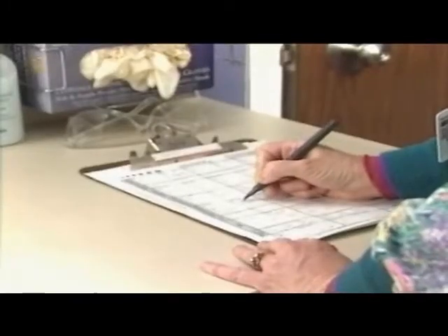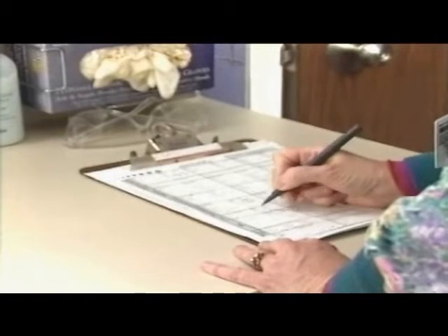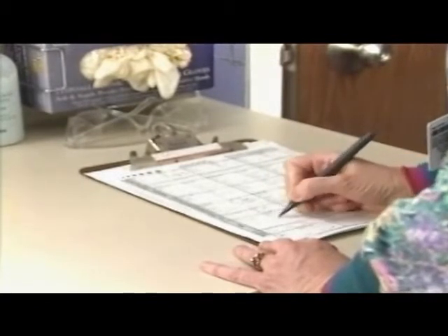Record appropriate information including color, amount, consistency, and the patient's response to the procedure. Include related patient assessment information.